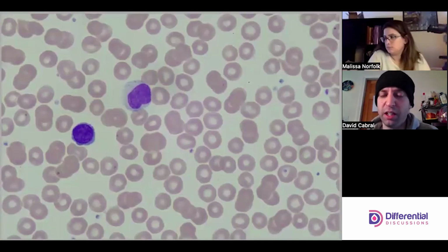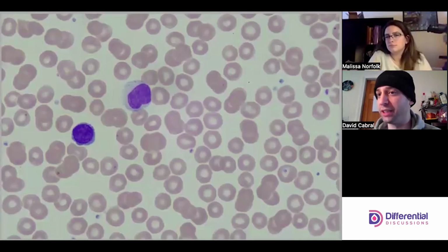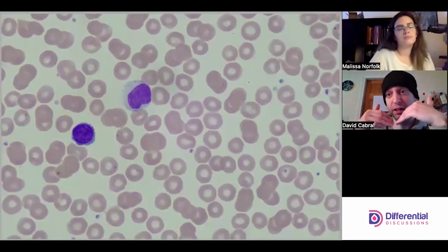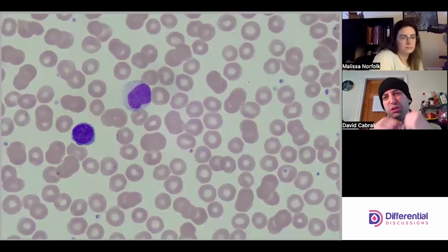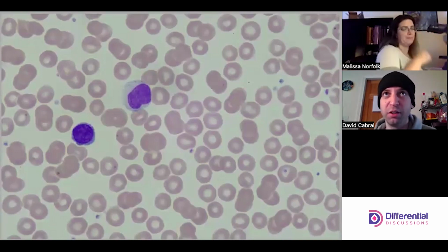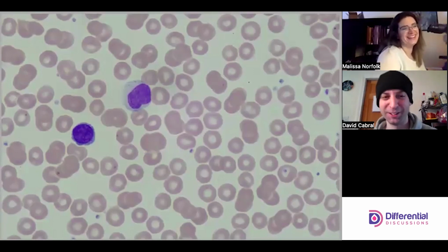Right. So initially, the very first lymph that we went down on and started looking closely at, the thing I wanted to try to be sensitive for was Sézary syndrome. So I'm looking for whether or not this indentation or cleft that could be normally appearing in lymphs has a continuation through the chromatin pattern to create almost two like hemispheres, that's not good. And we'd have to rule out a Sézary syndrome or, what is it, mycosis fungoides or whatever, depending on the staging of the disease.